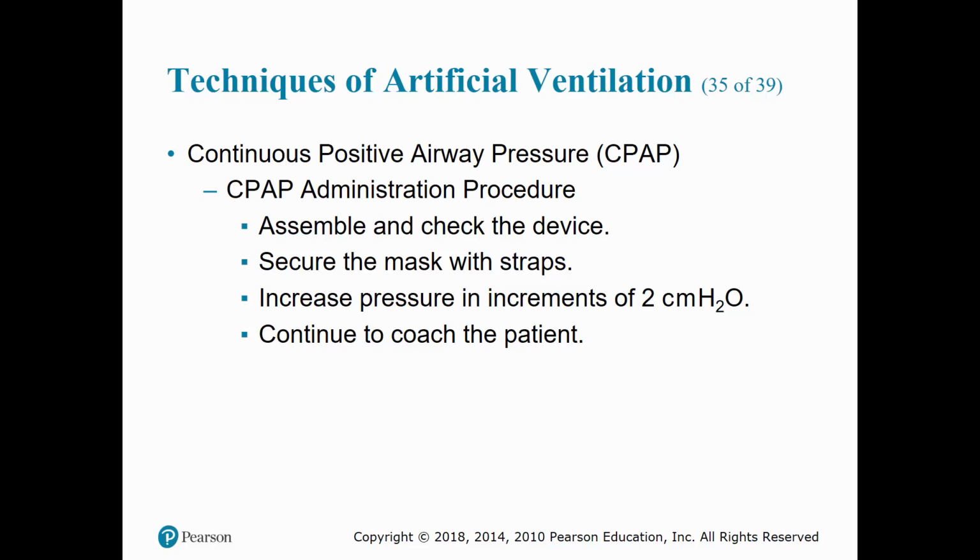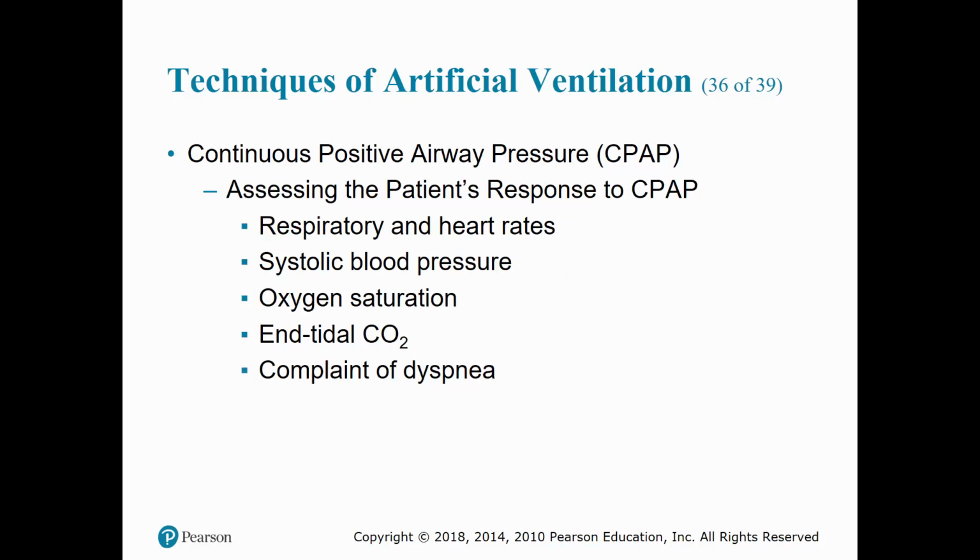Once you apply the CPAP, we cannot take it off until we get to the hospital, or if you run out of oxygen or the patient stops breathing. You also want to make sure that you are assessing the patient's response to CPAP, whether by watching the respiratory rate, because you should see a decrease in their rate. Their heart rate should begin to improve as their oxygenation levels improve.